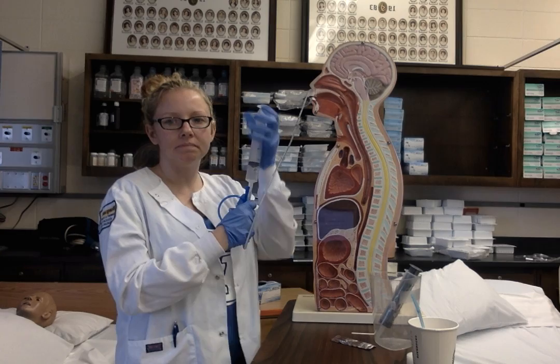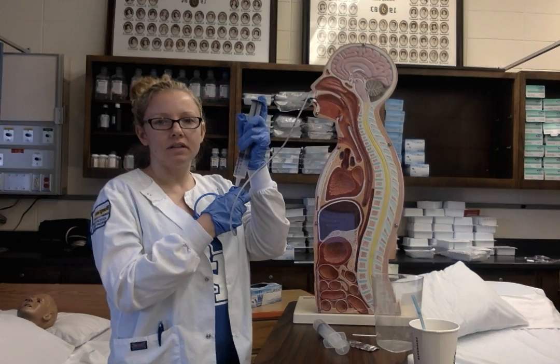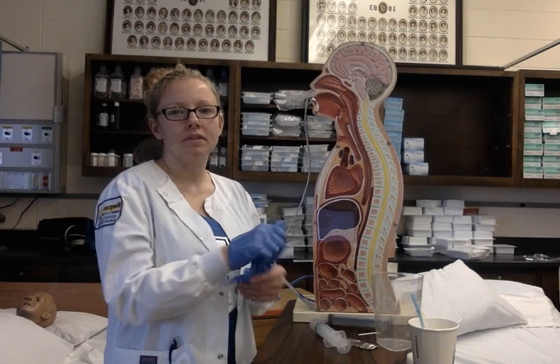I'm going to inject air into the blue tube into the stomach. Then I'm going to reconnect the NG tube to drain and suctioning. Then I'm going to remove the gloves, assist the patient to a comfortable position, and measure the return solution.